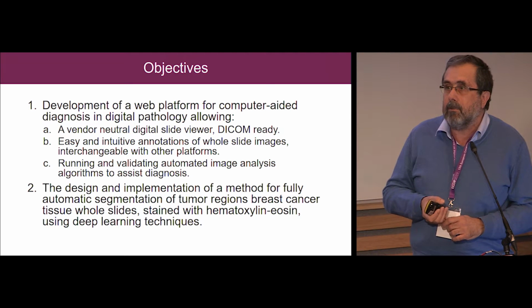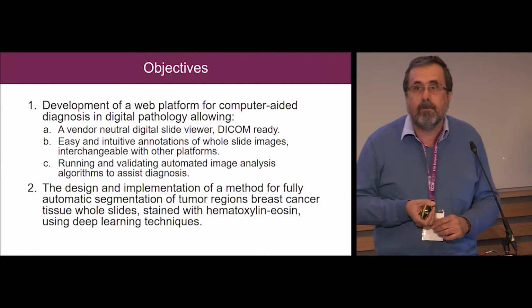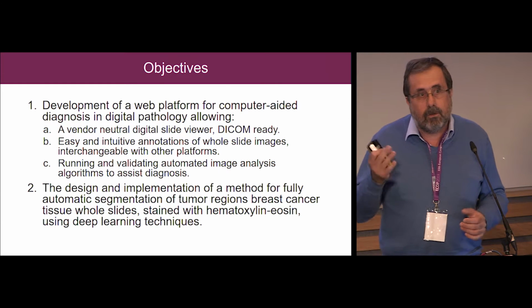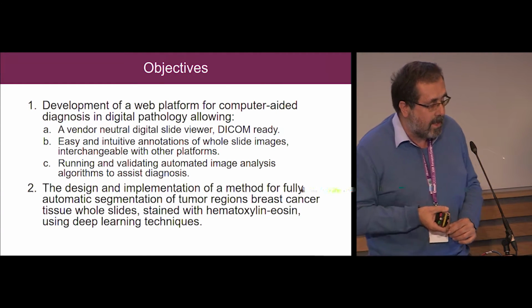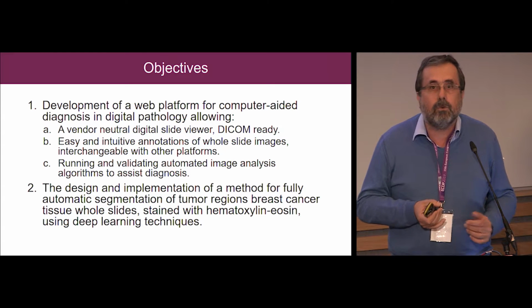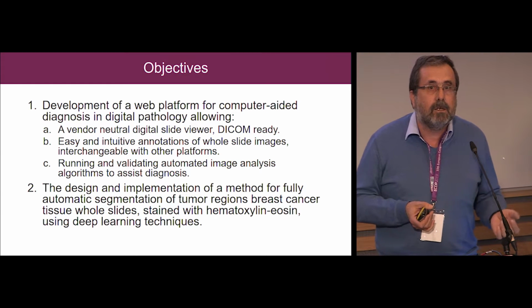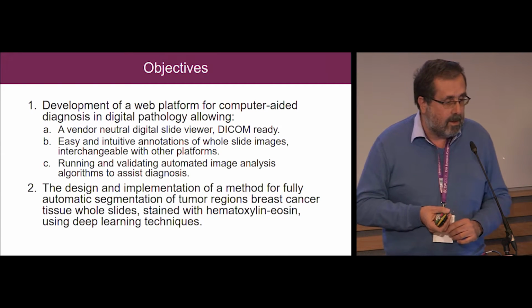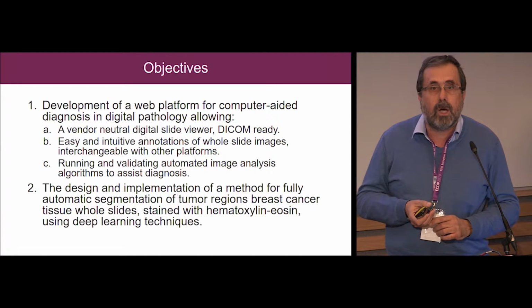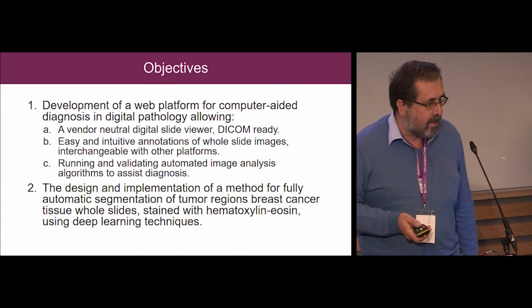So first you get the proprietary format, for instance, in 3D HISTECH, and then we could convert them to DICOM thanks to the work in collaboration with David de Mena and also with the BC Lab group in Ciudad Real. Okay, the good news is that with the Roche DP200, we had the possibility to generate these DICOM files directly without a previous conversion. So this work was done later, but the results I'm going to show now are only based on the images that were converted from the 3D HISTECH scanner.